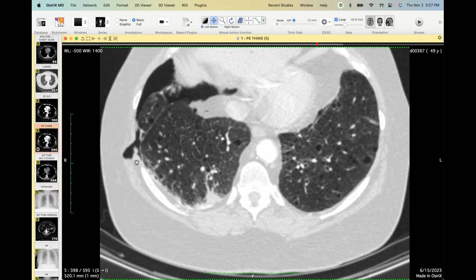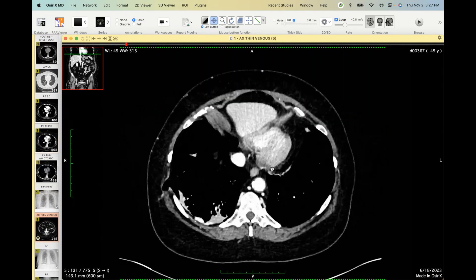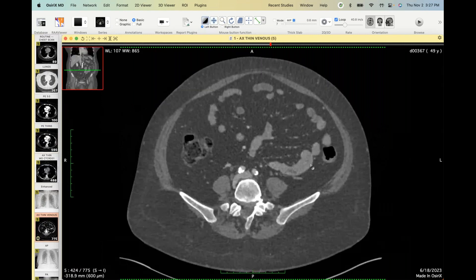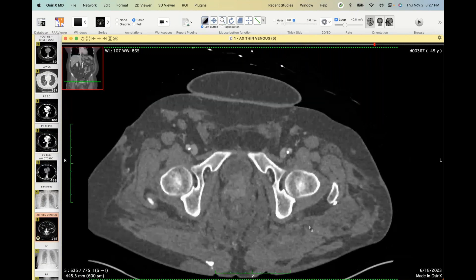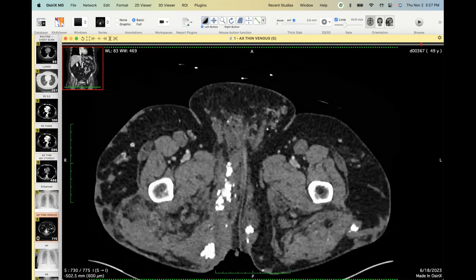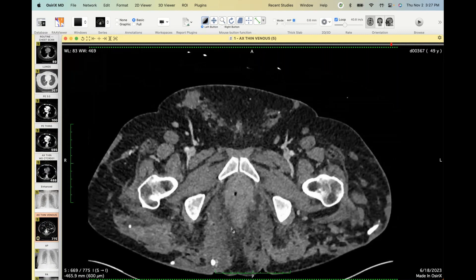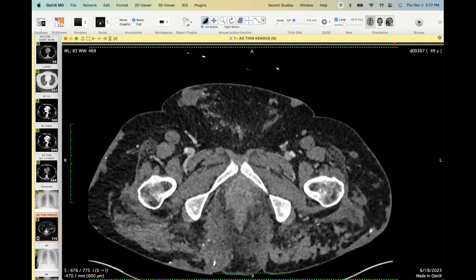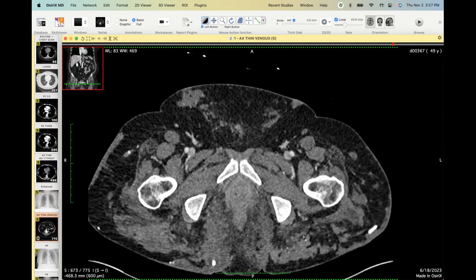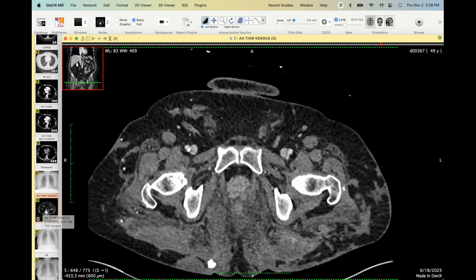She's not a smoker, no history of endometriosis, and the biopsy showed no malignancy. The pulmonologist asked me what I thought. When I scrolled through the abdomen and pelvis CT, I saw something interesting — what looked like prior silicone injections, with a lot of calcification and areas resembling fat globules consistent with silicone. Long story short, the pulmonary team talked to her and she had had unlicensed free silicone injection into her gluteal regions about 20 years ago.